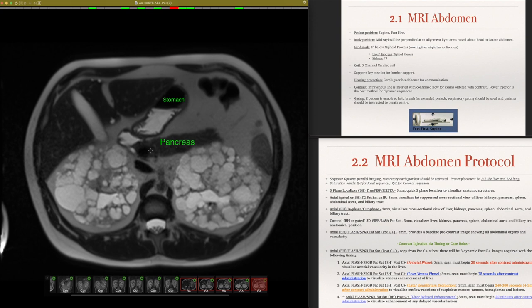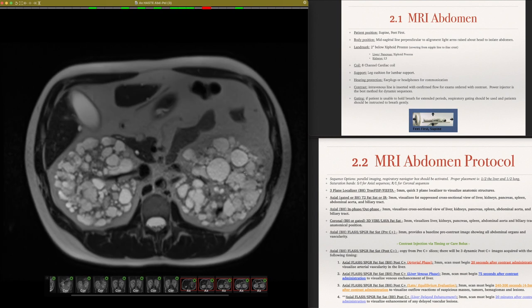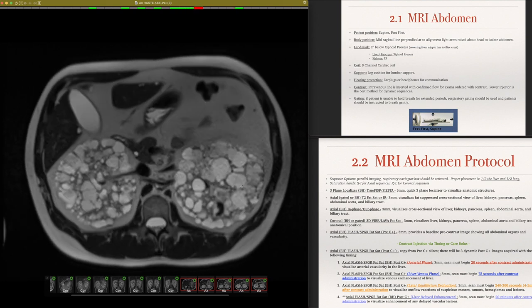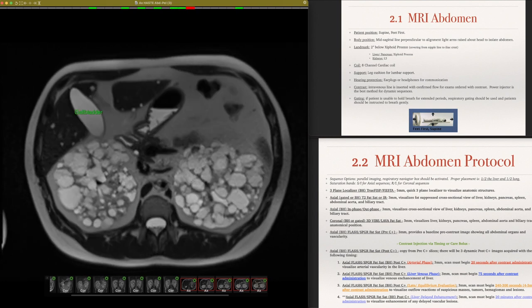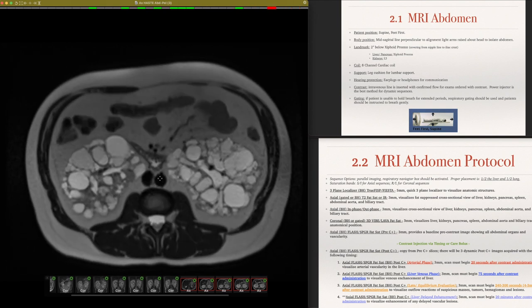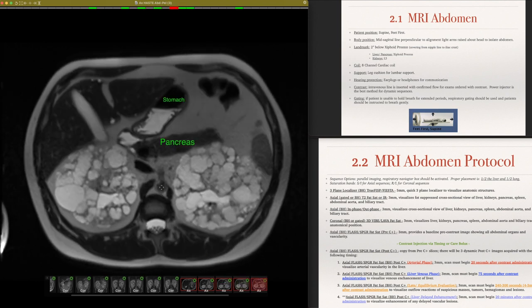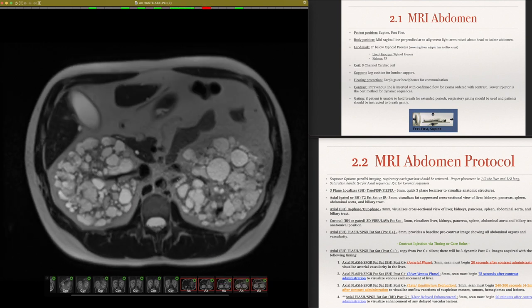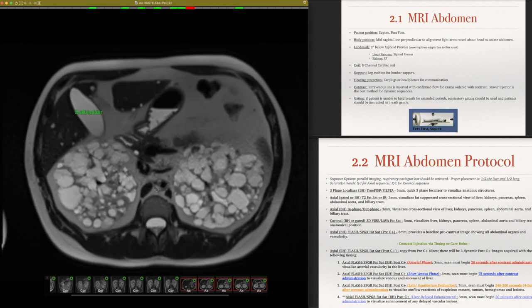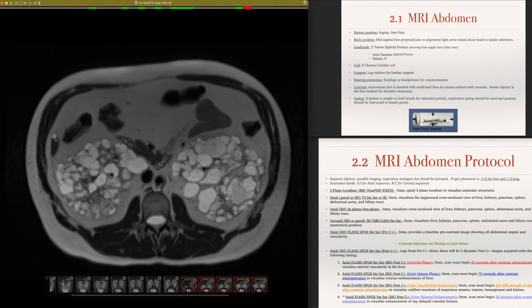Pancreas again here. Doesn't seem like there are any cysts in this pancreas, which is good for this patient. And again, scrolling through, we're able to see the abdominal aorta, okay, right here in the center, okay, coming up, and you can see them branch off to the left and the right kidney, okay, vena cava to the left, some measurements on these kidneys, fluid-filled cysts.